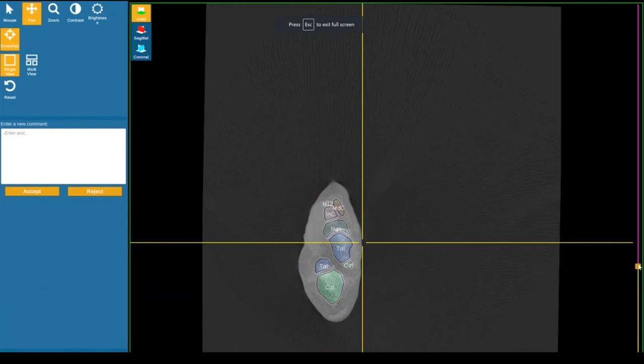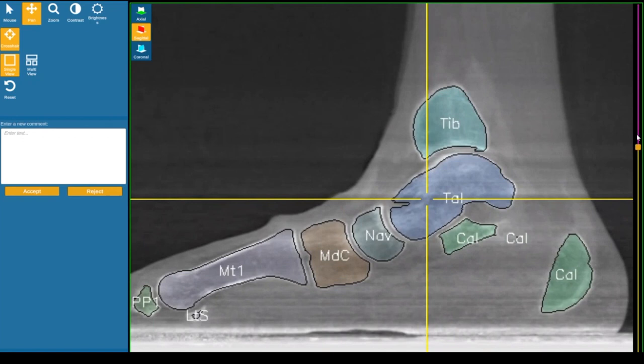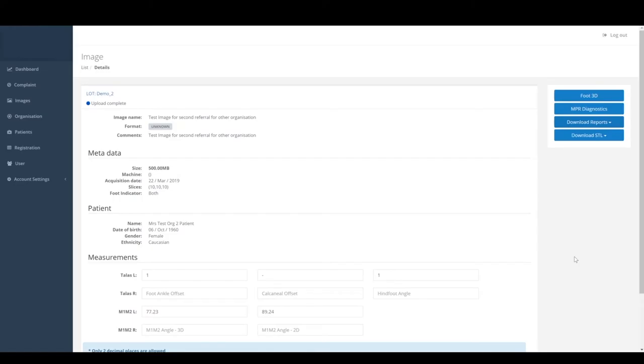You can review the segmentation and MPR slices. You can also provide comments and feedback to indicate whether you agree with the clinically identified bones.